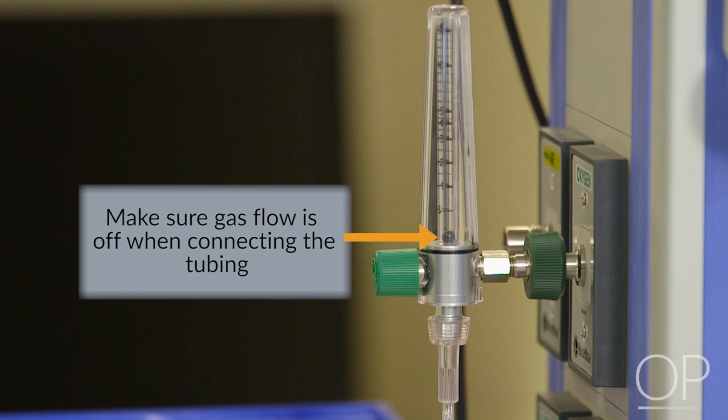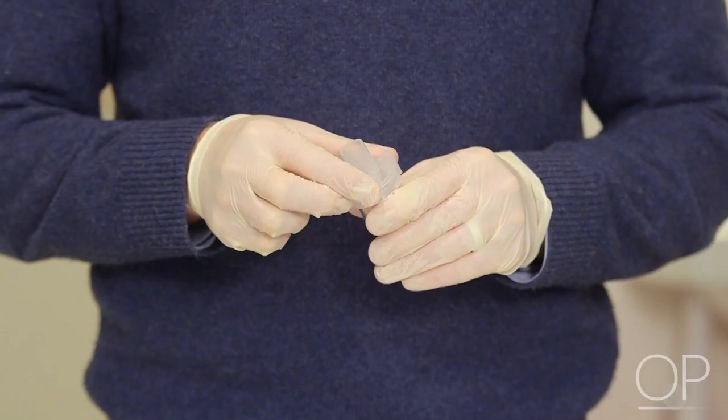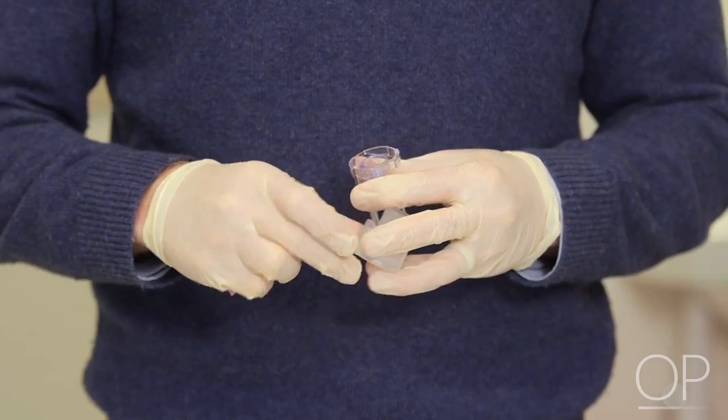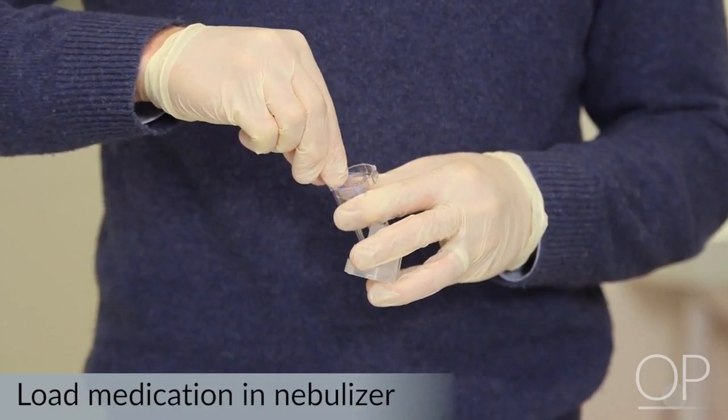You should wait until the setup is complete and the device is adequately affixed to the child before you start the gas flow. This will minimize the amount of wasted drug and maximize the received dose. Next, I have our drug. I've removed the cap and I'm going to take our medication, which is in a liquid suspension, and place it inside the device.